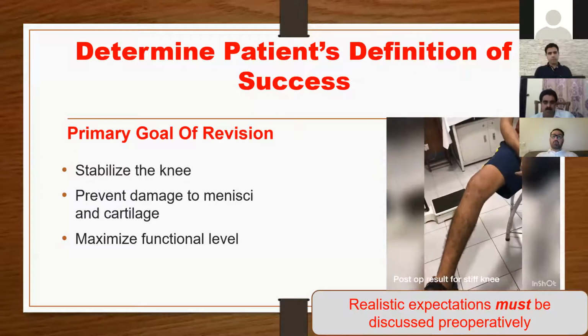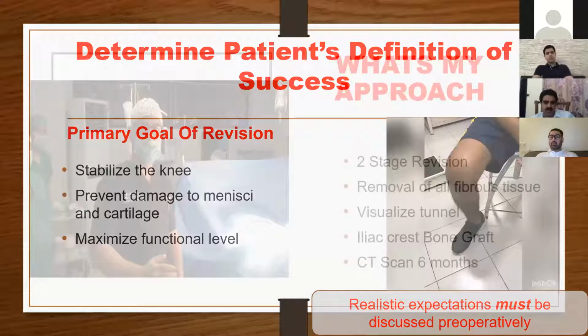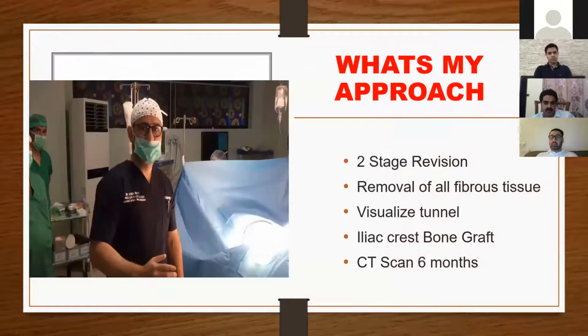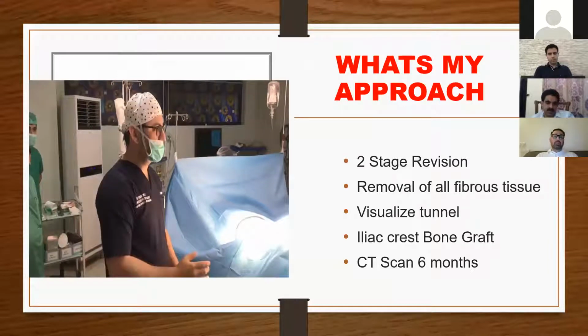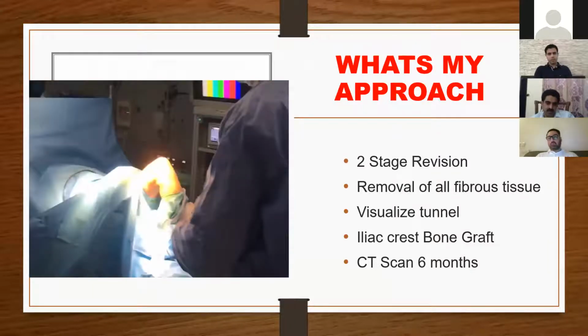So what's my approach? I do a two-stage revision. I remove all the fibrous tissue. I visualize the tunnel. I use iliac crest bone graft, do a CT scan after 6 months, and then plan the revision. As you can see, I always prepare the iliac crest.